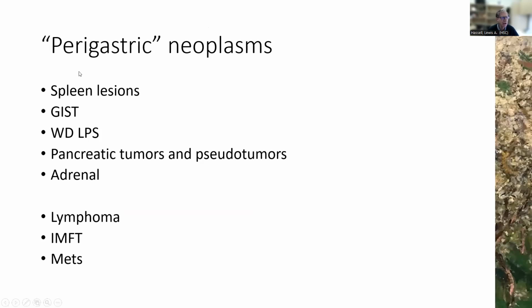So it's important in this particular kind of location to think about the things that live nearby the stomach. While this might be a primary gastric neoplasm, such as a GIST, you've also got the spleen nearby, and so benign and occasional malignant lesions from the spleen could be presenting in this manner. Although peritoneal spread would be a little bit unusual with most splenic lesions, unless it was a case of post-traumatic splenosis or something of that sort, where the spleen was becoming hypertrophic and perhaps you had an accessory lesion going on.